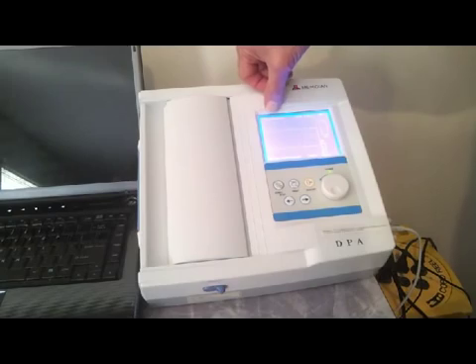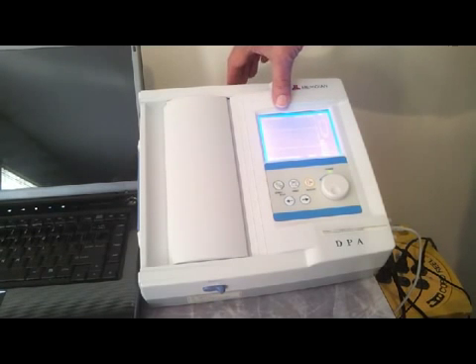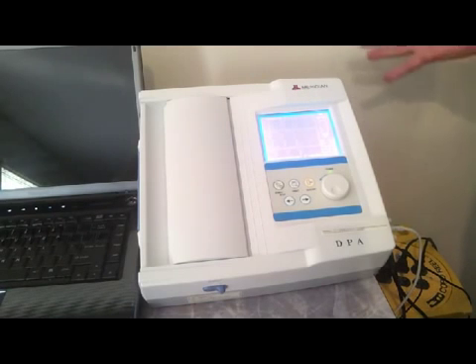It begins by saying 'initializing' and it'll do that for a few seconds, and then that'll convert to 'measuring' and you'll start seeing the information come across.